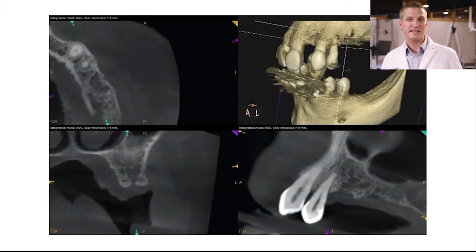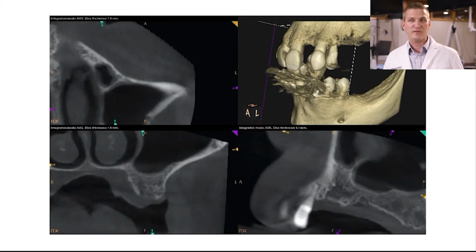So here's number 13. As you can see, a kind of a weird radiolucency in the bone. So decent bone quality other than that low density area. I'm not concerned with it. I've thoroughly examined the area. I don't see any foreign body or any concern there. I think that's going to be just fine, but that is where our number 13 implant is going to go, is right there. Number 14 implant, as you see, we have a little bit of a low sinus.